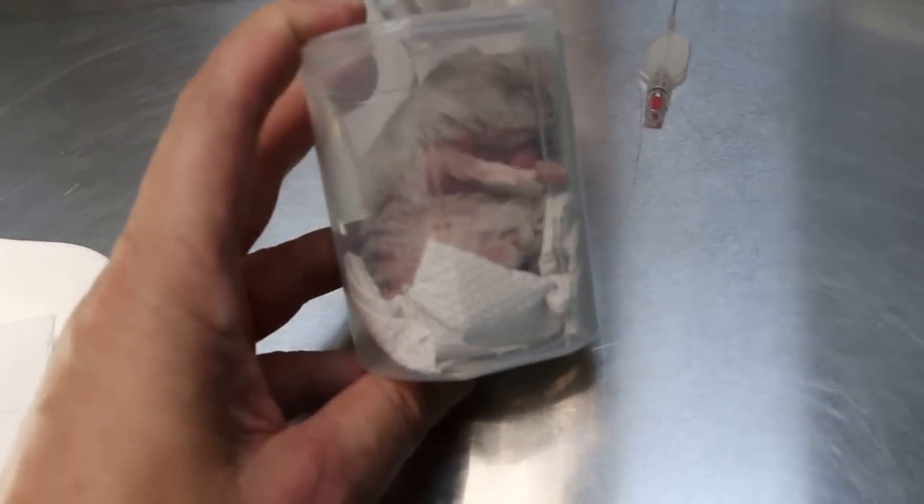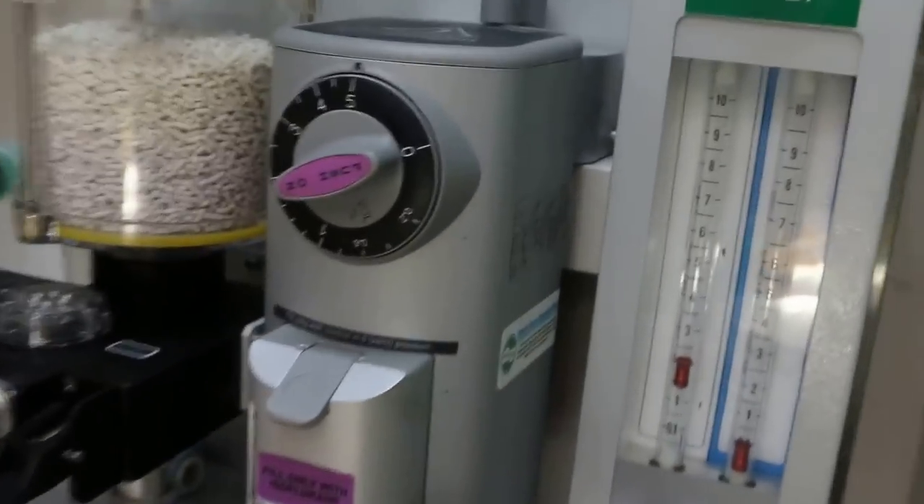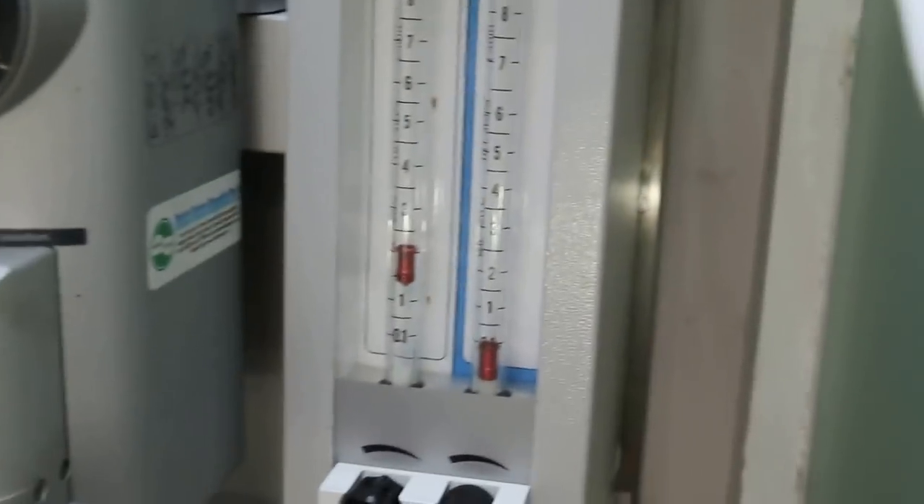We give isoflurane gas at 5% and a flow rate of about 2 liters per minute. In less than 1 minute the hamster is anesthetized, and you can see the hamster is anesthetized.